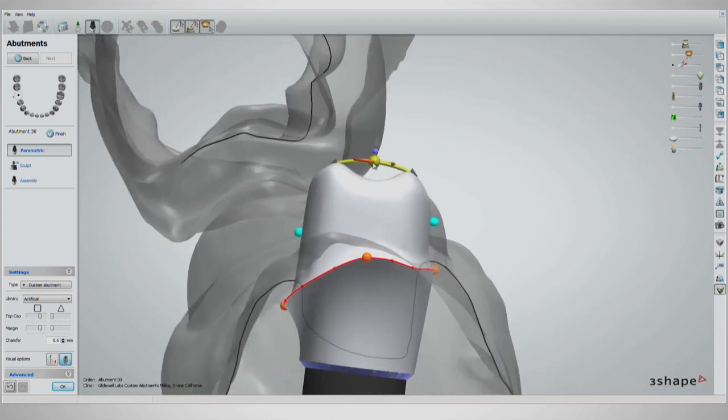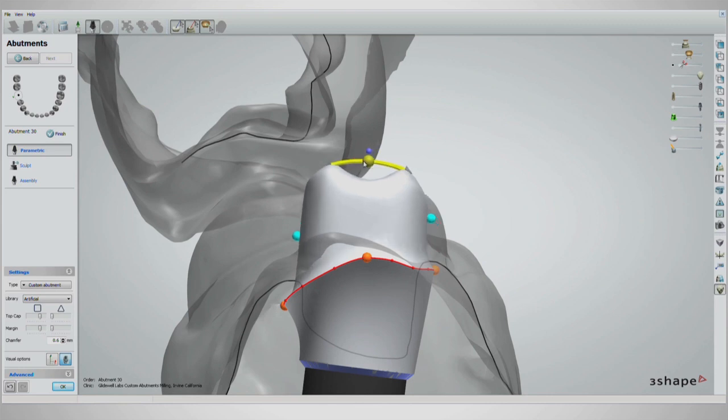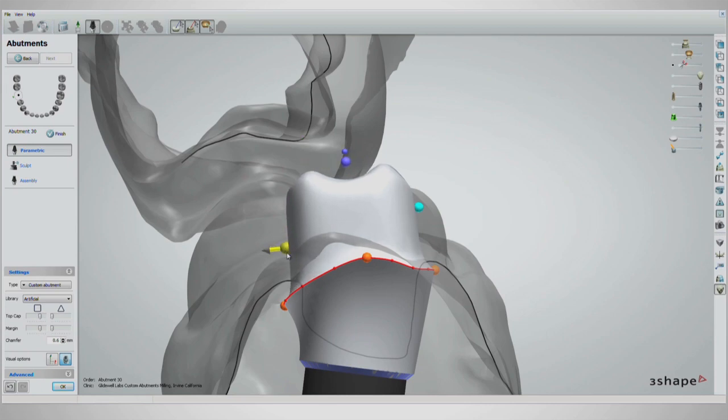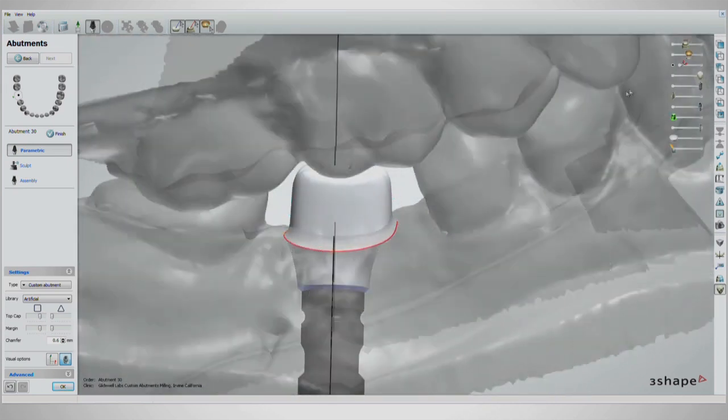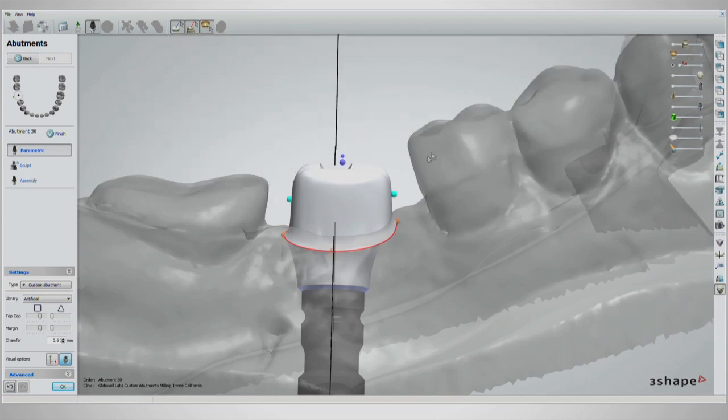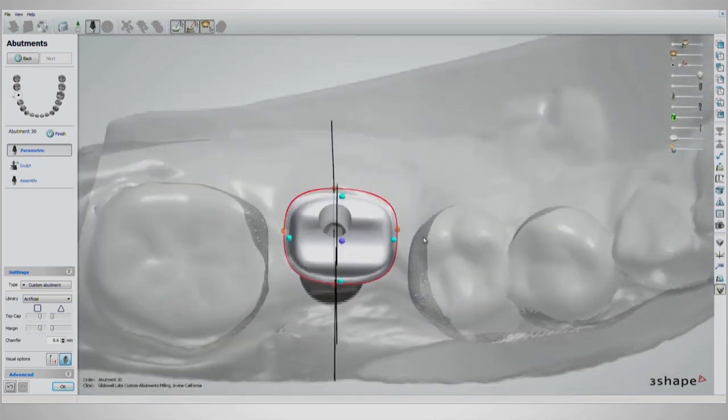The abutment can be angled by clicking and dragging the large purple handle. You can angle the abutment buccal lingually while viewing from the mesial or distal, or mesial distally by viewing from the buccal or lingual.